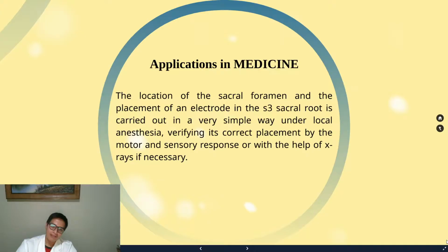Application in medicine: the location of the sacral foramen and the placement of an electrode in the S3 sacral root is carried out in a very simple way under local anesthesia, verifying its correct placement by the motor and sensory response, or with the help of X-rays if necessary.